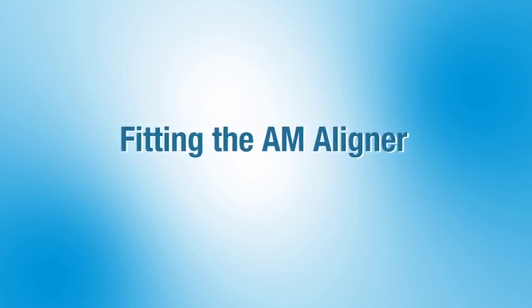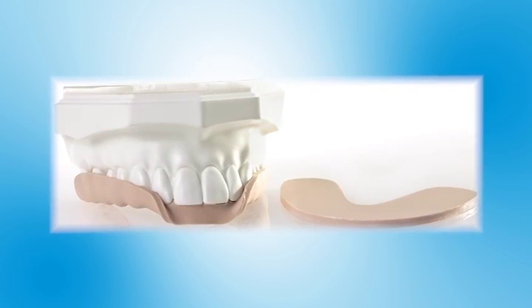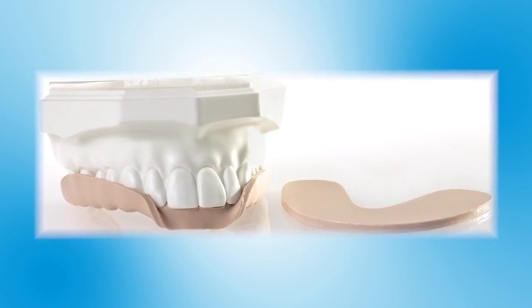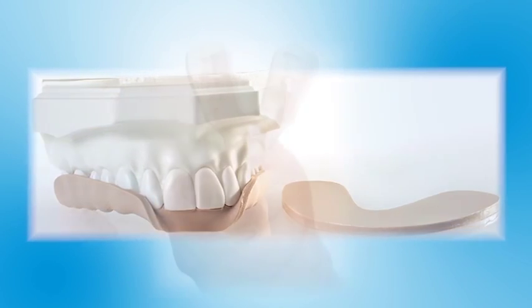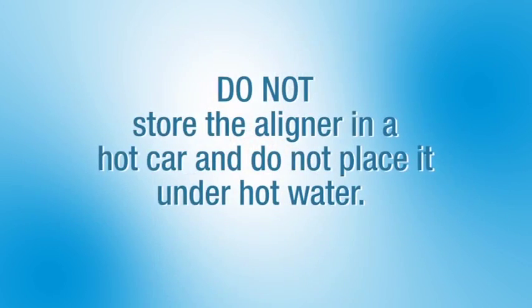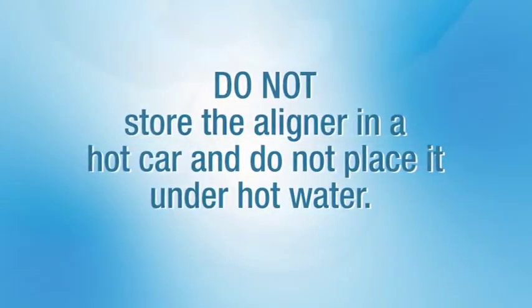Fitting the AM aligner. The purpose of the AM aligner is to help return your jaw to your natural bite position after it has been pulled forward by the myTAP. The AM aligner is made from a heat-sensitive material. Do not store the aligner in a hot car and do not place it under hot water.